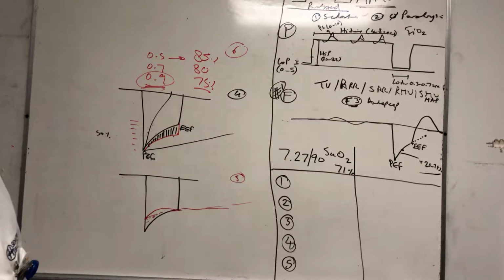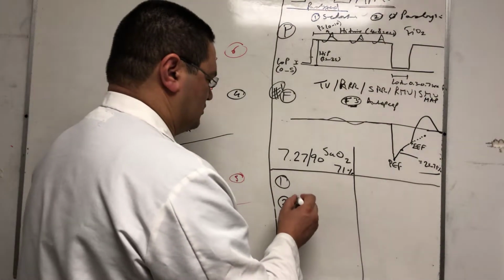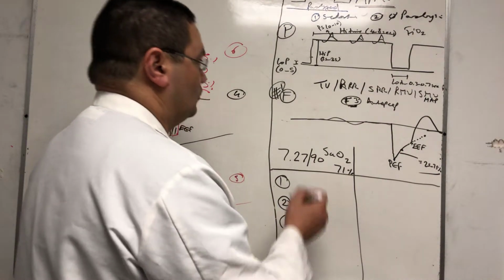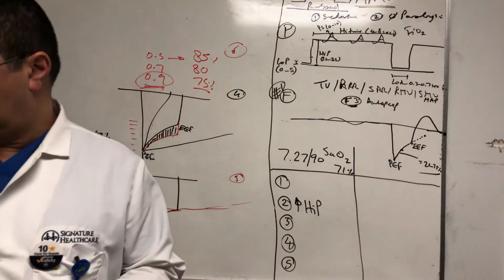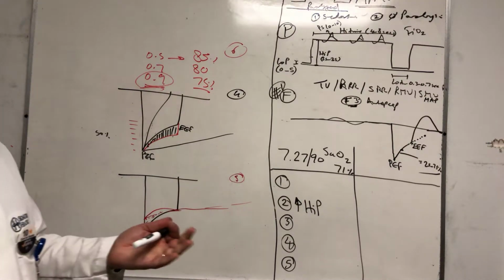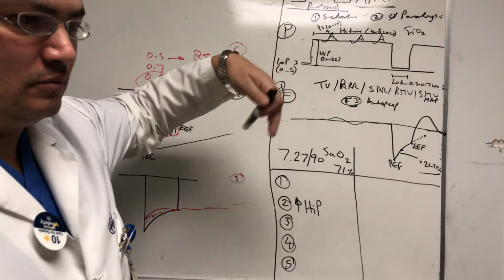Increase the high pressure? Increase the high pressure, absolutely. All right, so let me ask you this. Where is the PEEP in this mode? The answer is there's no PEEP, right? We never mentioned the word PEEP here. It's high pressure, low pressure, high time, low time.